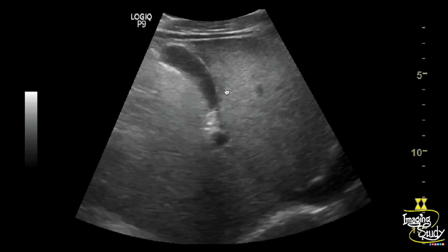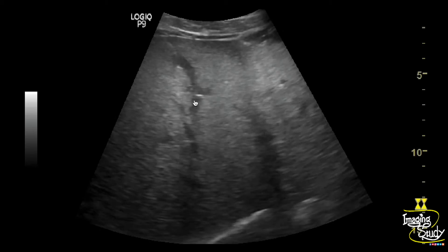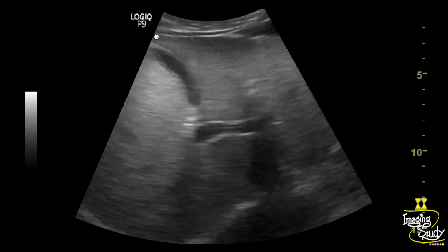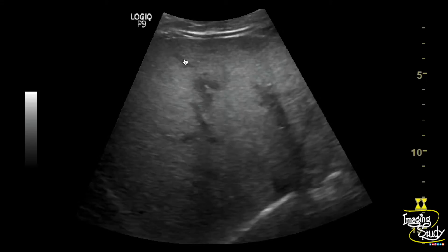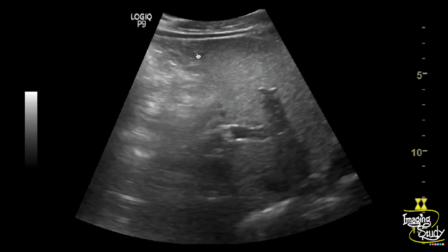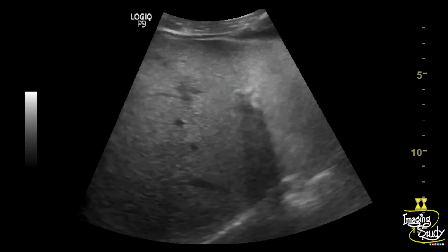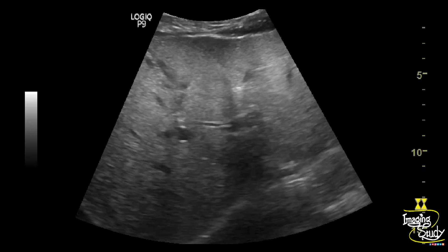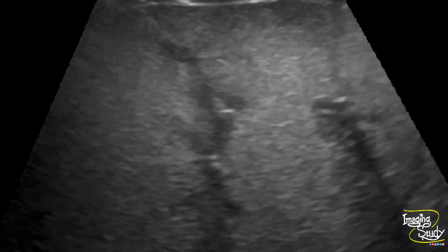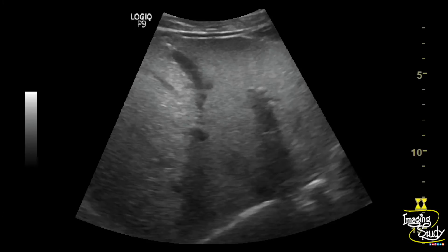This hypoechoic area is not causing any compression over the adjacent blood vessel or displacing it. You can see another one adjacent to the anterior gallbladder wall. So these hypoechoic areas are known as focal fat sparing areas — they are the only part of the hepatic parenchyma that has no fat deposition.